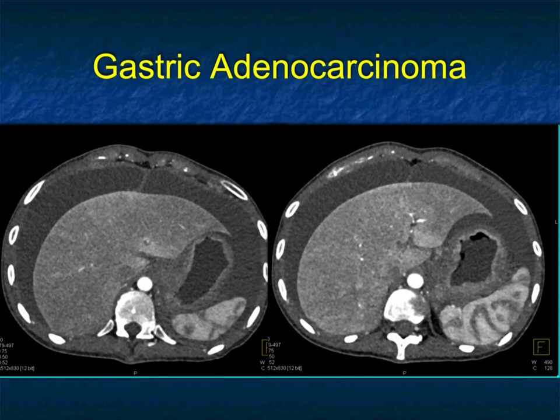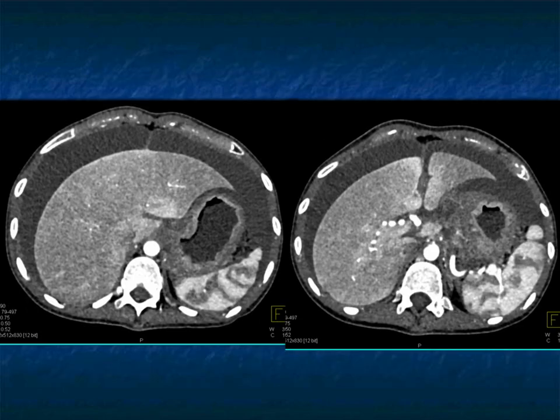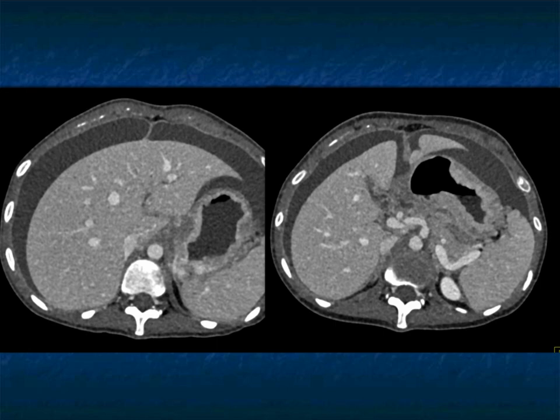Gastric adenocarcinoma can be focal, with ulceration, or diffuse and infiltrating. Key things, of course, are protocols — give the patient oral contrast. We use water if it's a dedicated gastric study, positive contrast if we're looking for a leak. You can see the mucosal enhancement and wall thickening. As you scan down from the fundus to the body, the thickening increases. You can see ascites, perfusion changes in the liver, and adenopathy in the celiac and gastrohepatic chain as well as perigastric regions.